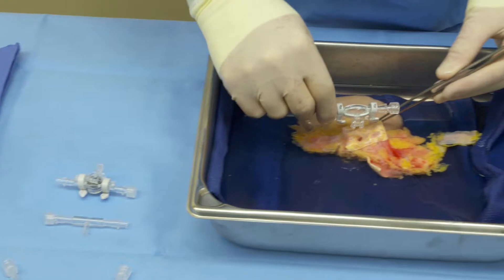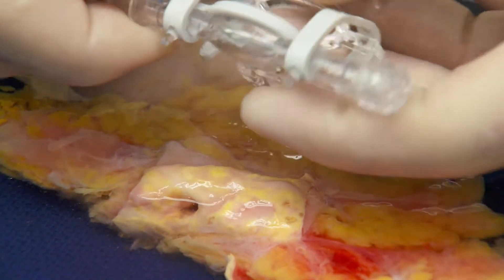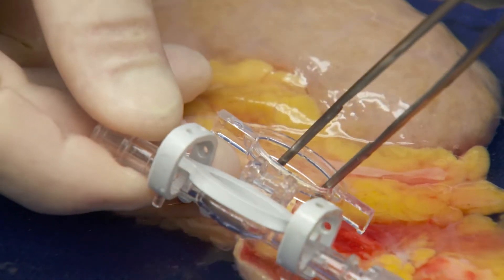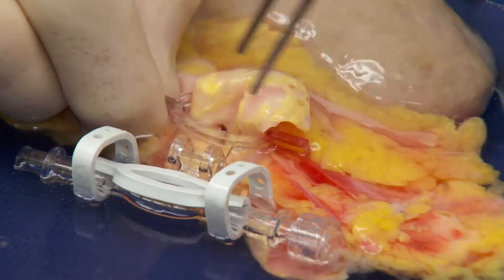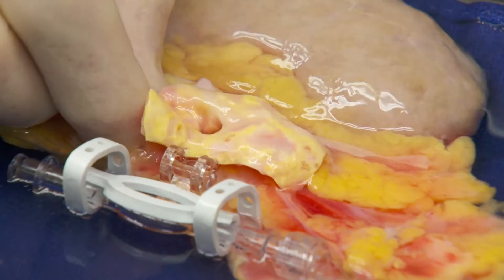Start by opening the cannula and placing the rigid bottom portion of the cannula over the aortic patch. Using a pair of non-traumatic forceps such as DeBakey's, reach to the center of the rigid plastic portion and gently pull the patch into position on top of the cannula.